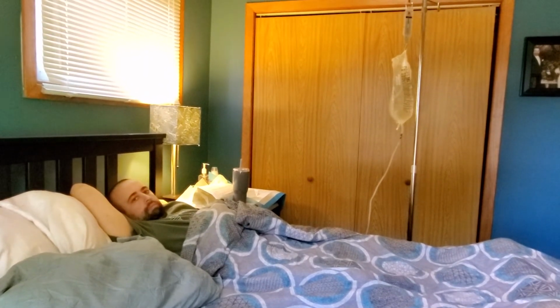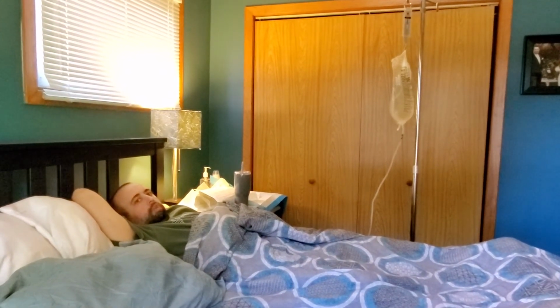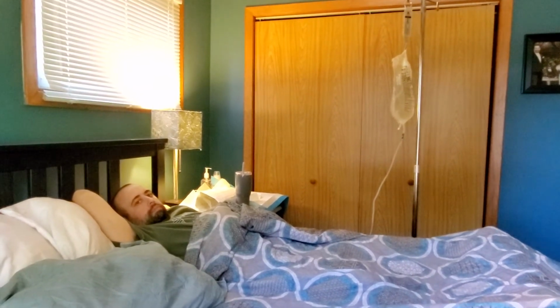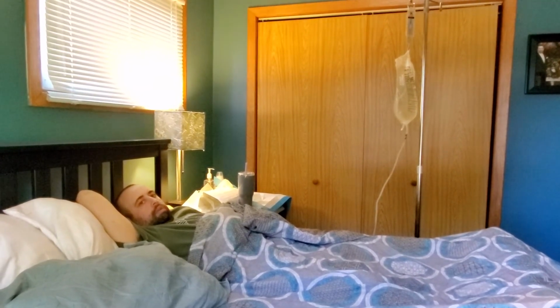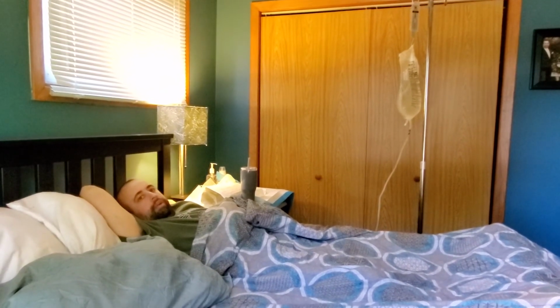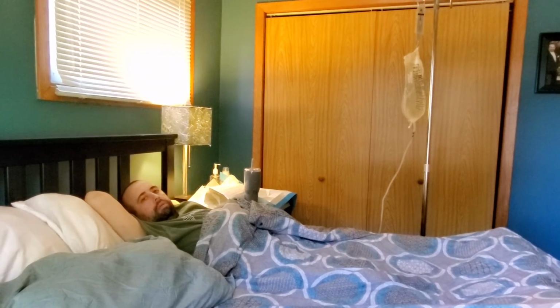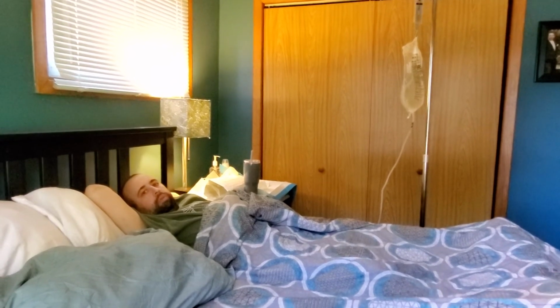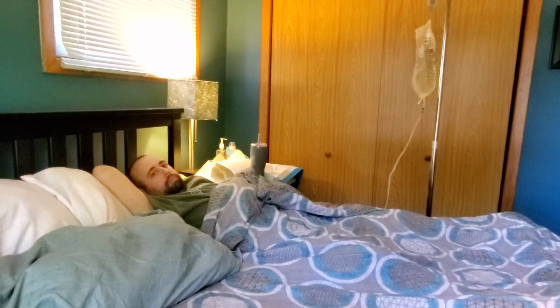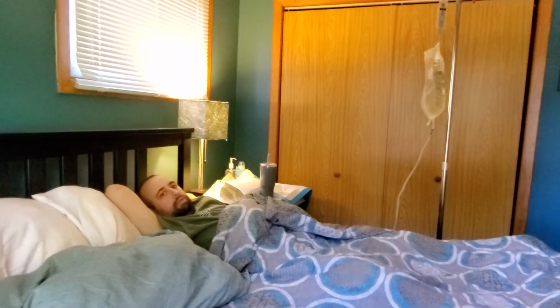So with the manuals, currently he's doing 2 cycles each day, which would be a total of 4,000 milliliters in and out of his body. And then, yeah, the idea is that it'll take some extra out, as it's pulling the things out of your blood that your kidneys normally would do. The solution is doing that for me. So it'll pull protein, I believe, potassium. It pulls a whole bunch of stuff out.